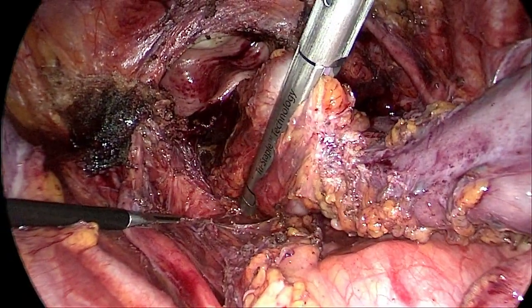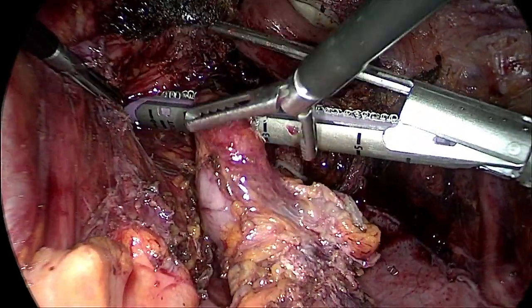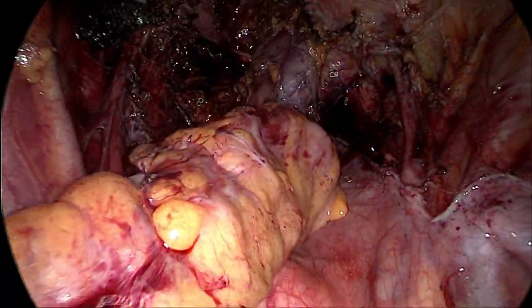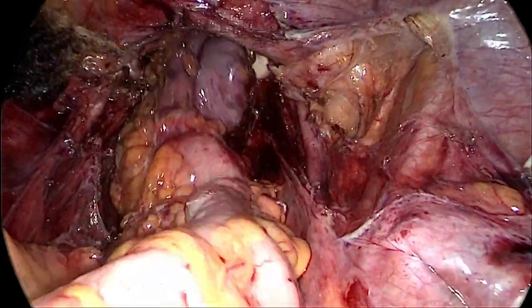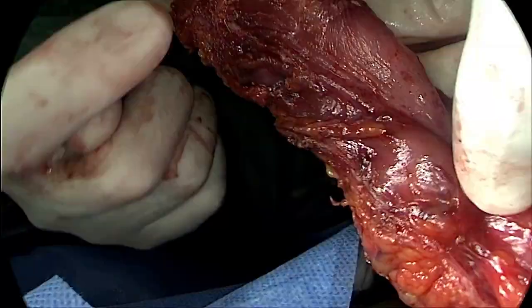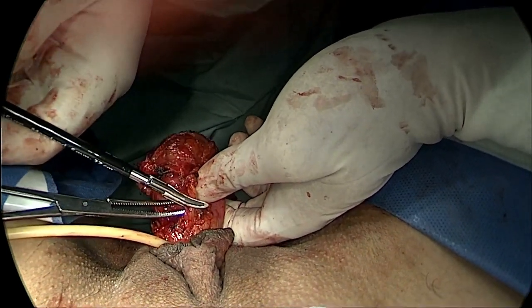Two stapler firings using a purple linear stapler, 60 mm, were necessary to execute the resection. The intestinal segment was externalized through the vaginal vault, where the endometriotic lesions were identified and resected.